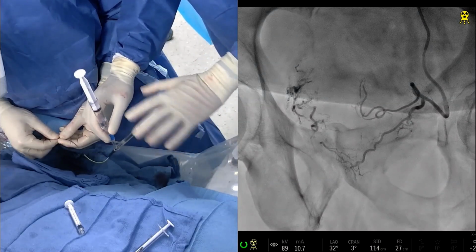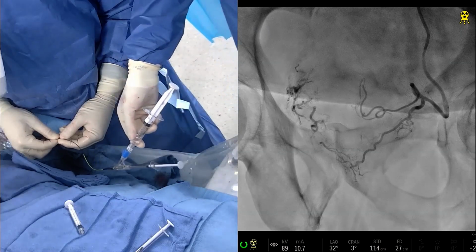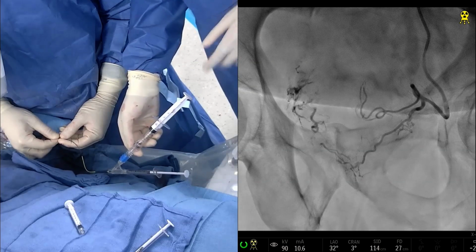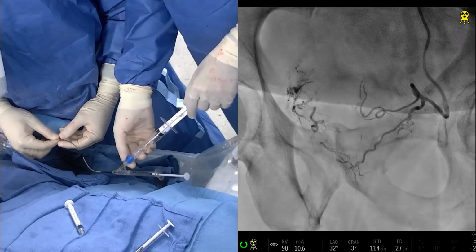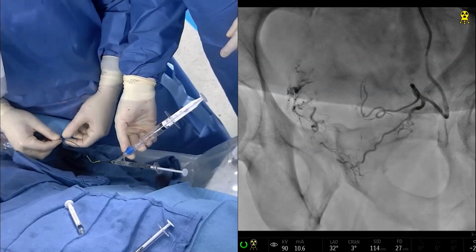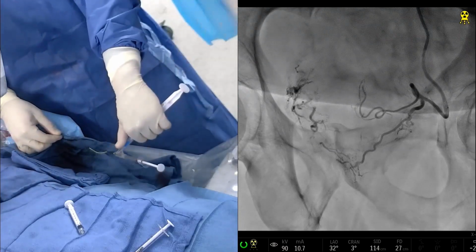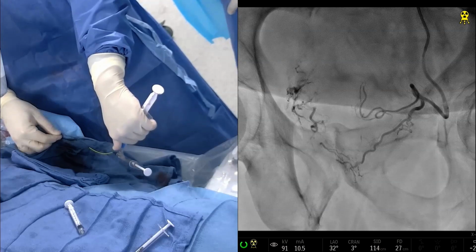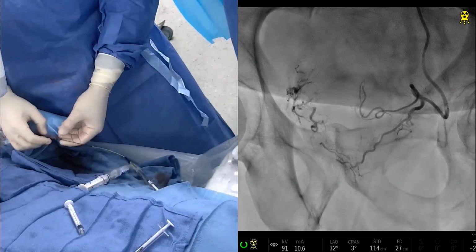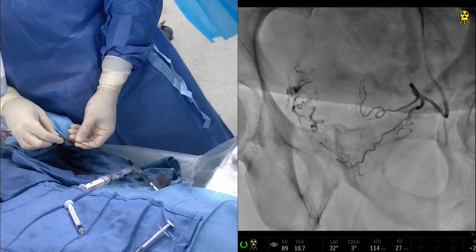Okay, that's good. Yeah. But there's your branch going outside the prostate. See, that's what I was talking about before. And so the nice thing about balloon occlusion is you can actually let the balloon stay up until that material just stops moving because it's sticky, much different than other liquid embolics that are not sticky. And that's one of the big things that we love about n-BCA, it's sticky. And now I'm going to take the balloon down. You know, it's a plus and a minus, right? But in cases like this, it's helpful.